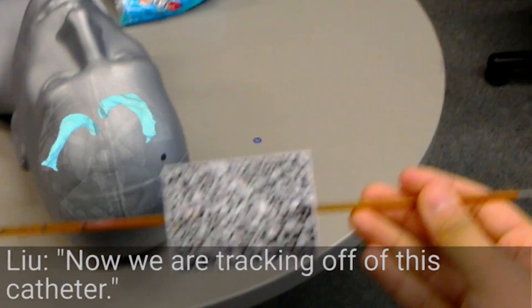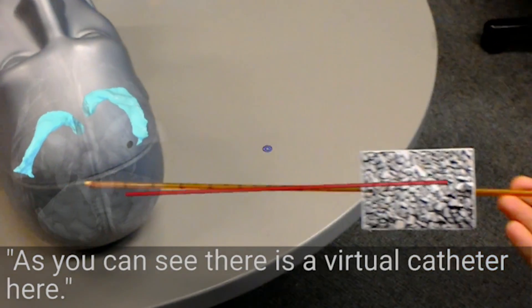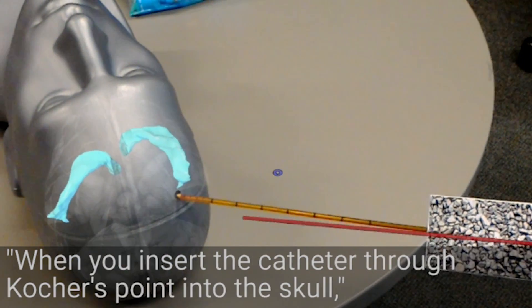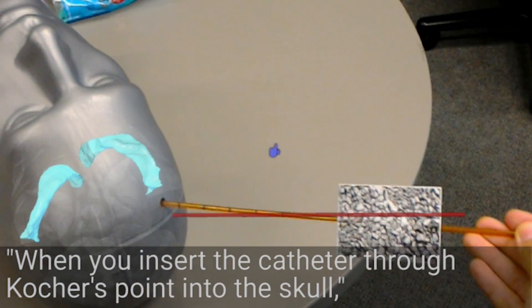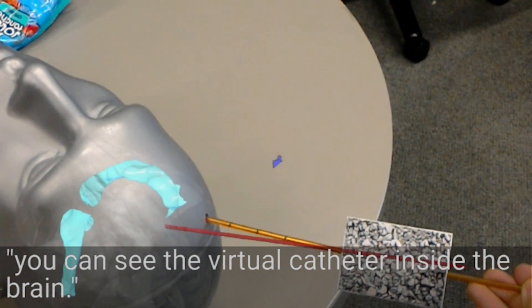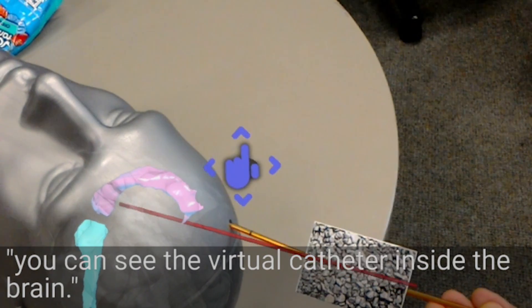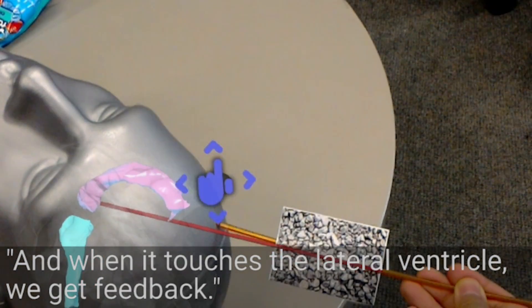And now we'll try to keep tracking of this catheter. As you see, there's a virtual catheter here. And when you insert the catheter through the entry point into the scalp, you can see the virtual catheter inside the brain, and when it touches the lateral ventricle, we will get feedback.